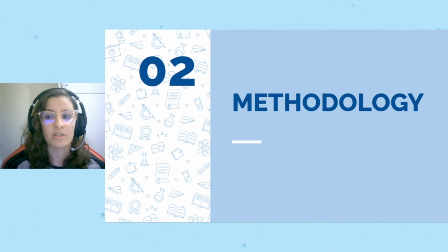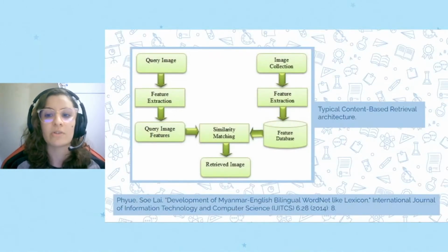To develop PathoSpotter Search, we used a typical CBIR architecture composed of a feature extractor followed by a similarity score calculator. First, the system will extract and organize a set of descriptors from the images. Those descriptors are typically a feature vector or embedding. The second task the system will perform is ranking the images according to a similarity score between the descriptors, usually computing the distance between the vectors and ordering them accordingly.